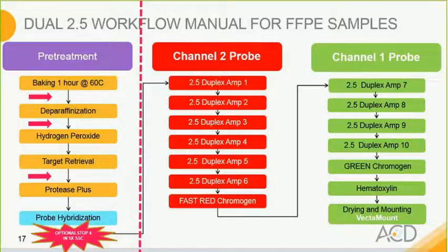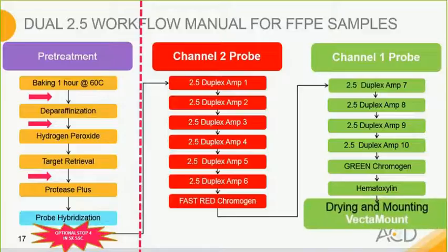And lastly, please pay special attention to the drying and the mounting step, where again we recommend VectaMount for the mounting procedure.